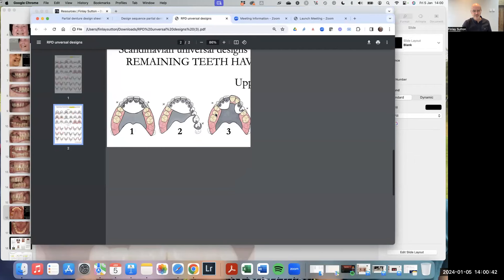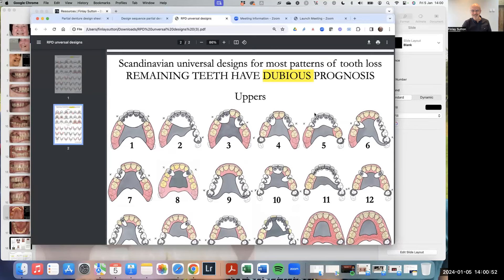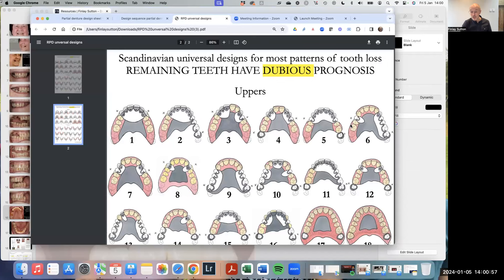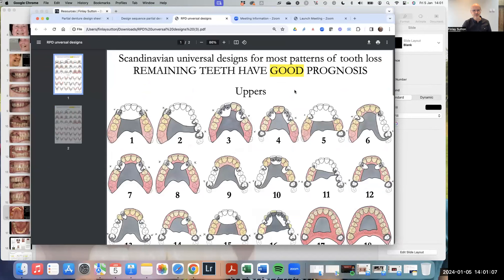We've got universal designs for all different combinations of missing teeth. Sylvia is at number five — she's like a mirror image of design number five. I just want her to keep all of these teeth. These upper front teeth aren't in bad condition, but just to protect them, I think backings are better. I've classed them as dubious prognosis teeth. If all of these teeth had really great prognosis, we'd scroll up to the upper design option there.